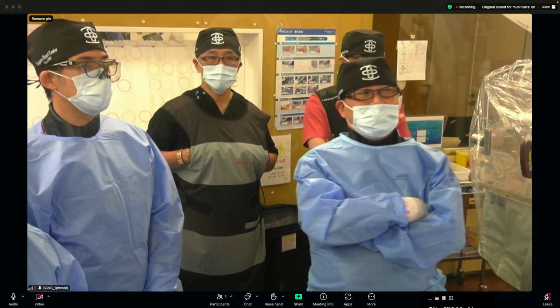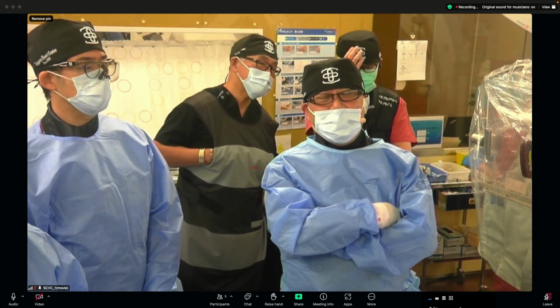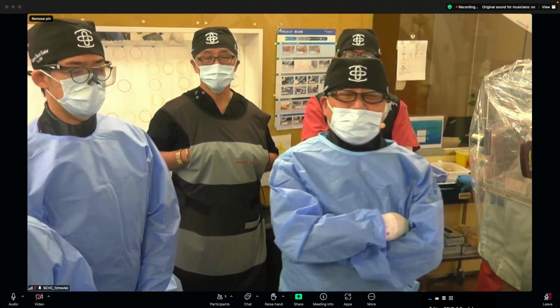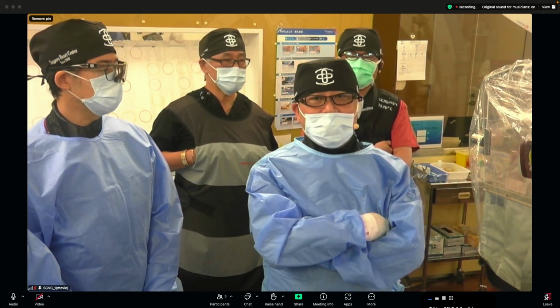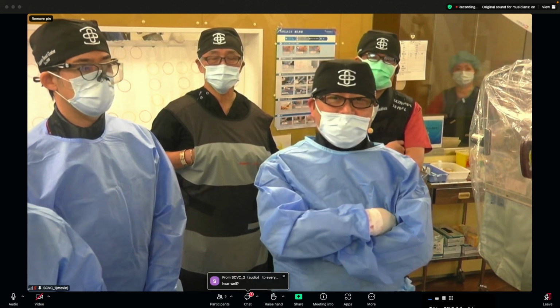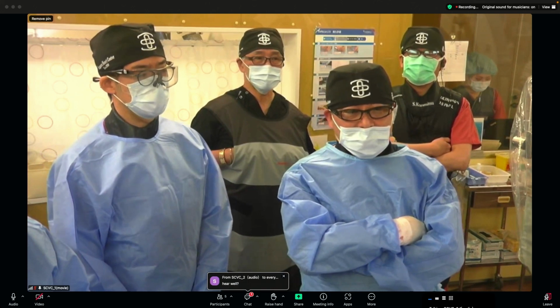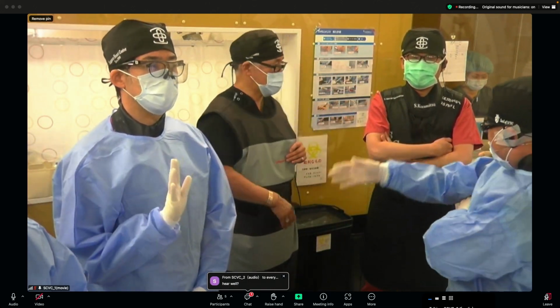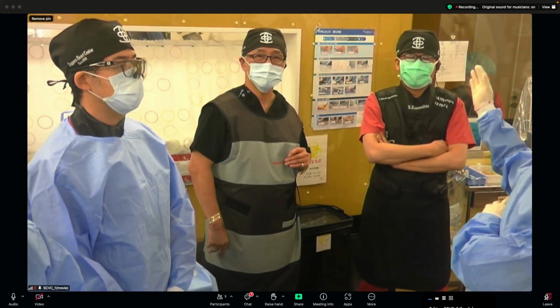Okay, thank you so much. Good morning, Adrian. Can you hear me? Very well. It is a great honor to become a live satellite in our hospital. Thank you to KK Sensei, Adrian Sensei, and the Singapore live staff. This is the second operator, Sugie Sensei. And this is Kuramitsu Sensei, a very famous IVUS analyst.